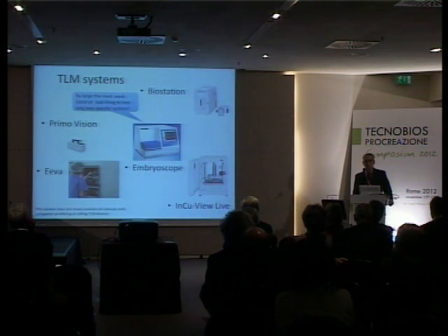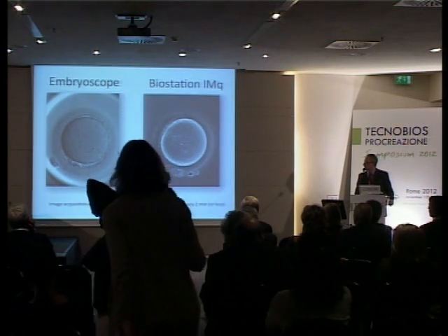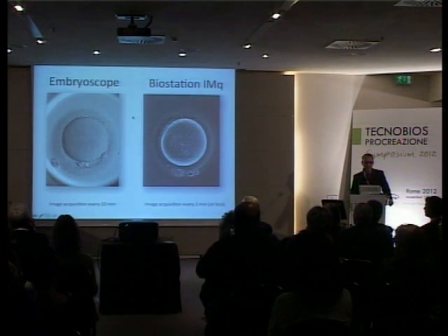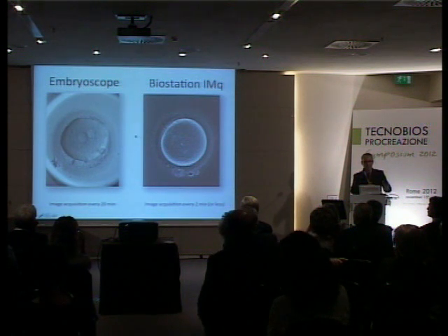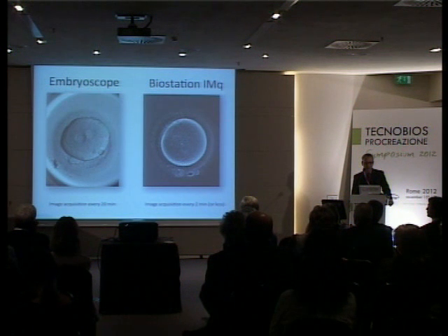On the other side, we possibly have some kind of limitation, and I want to show you what I mean by that. On the left-hand side, we have a recording of very early events of fertilization, polar body extrusion, and initial formation of pronuclei. And the movie is rather not entirely fluid in its progression.